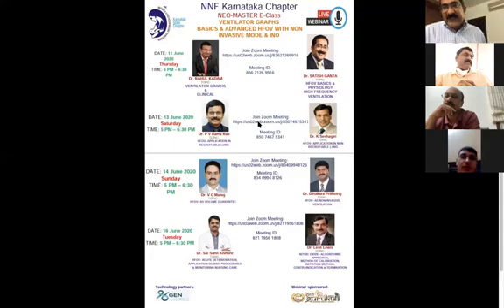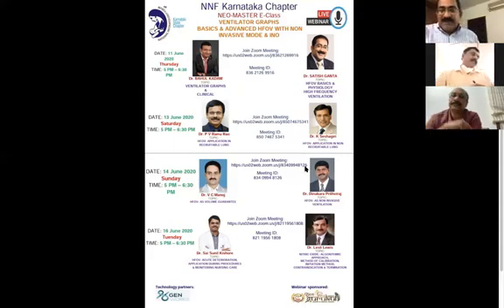See, what I've just said is first, your MAP. How do you choose? Again, first you should know what your MAP is on the conventional ventilation. If your MAP on the conventional ventilation is 18 or 19, you choose at least 2 or 3 above the conventional ventilation. That is only to start. But when you do the start, the next 45 minutes or 1 hour, it is all about recruiting the lung.